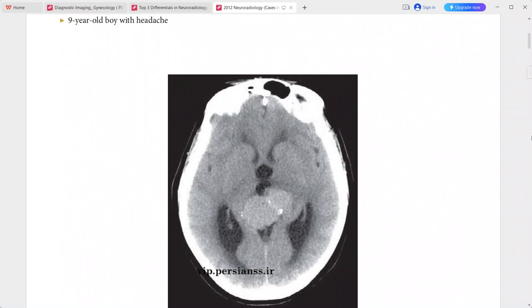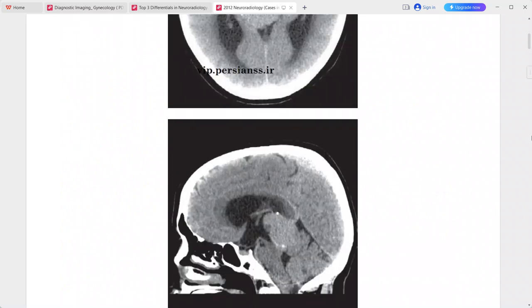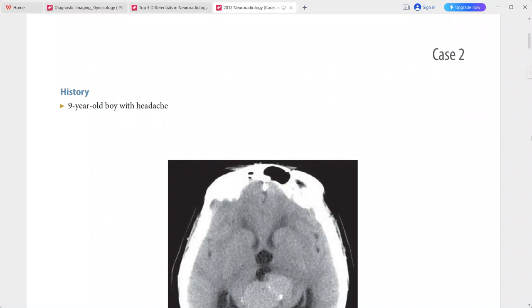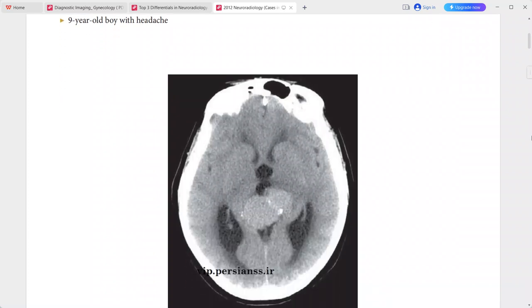Next case: 9-year-old boy with headache. This is a case of pineoblastoma. There is a large pineal region mass with peripheral calcifications, and it is generally of higher attenuation than the cerebral parenchyma.